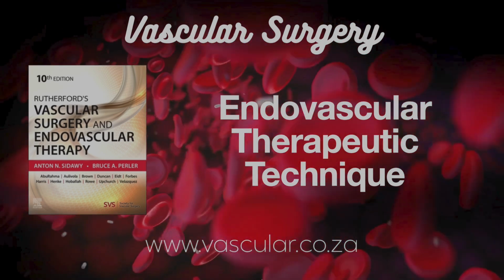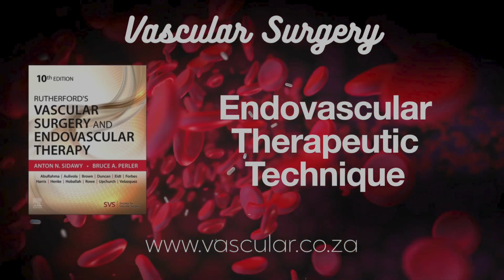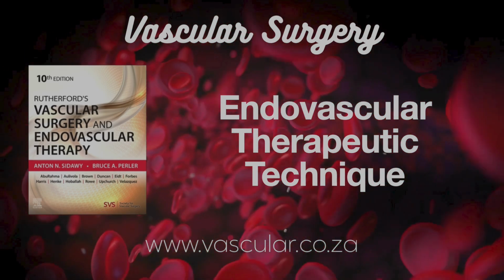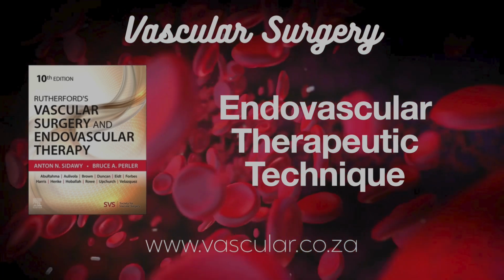Local anesthetic, always. Guidance: ultrasound can be invaluable, especially for tricky anatomy or antegrade punctures going down the leg. Helps pinpoint the artery. For below-the-knee work, ipsilateral antegrade CFA access is often preferred. Shorter path, better device performance.